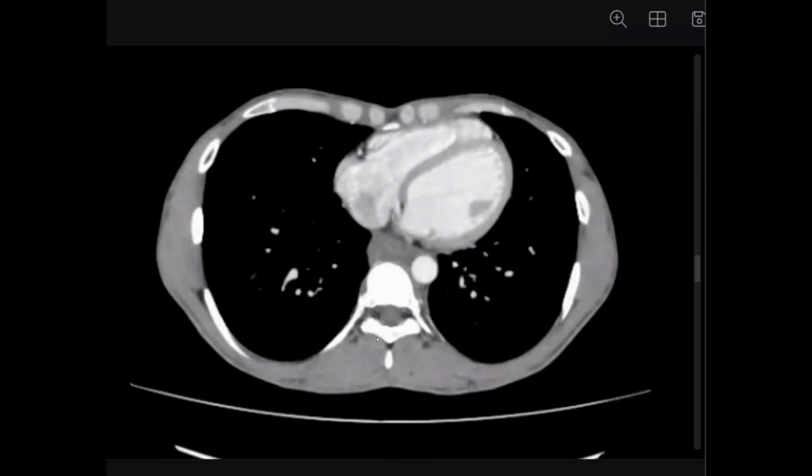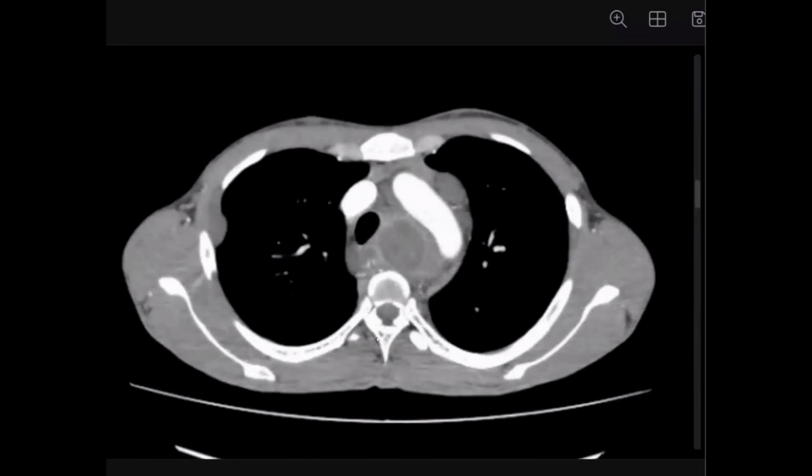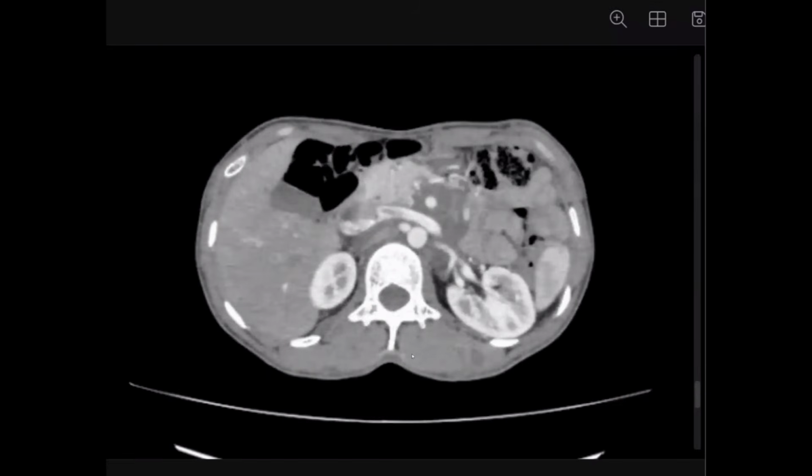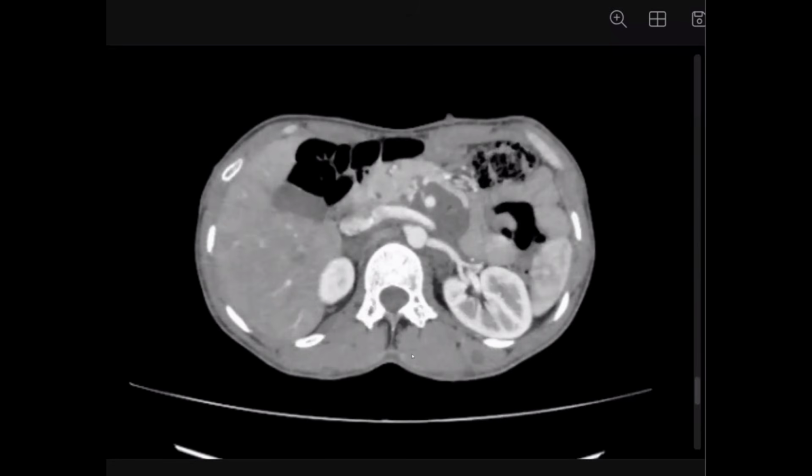Okay, what else? Retroperitoneal masses, maybe neoplastic. Nerve sheath tumors. We have retroperitoneal masses, maybe retroperitoneal sarcoma, neurogenic tumors, lymphomatous, germ cell tumors. But if I want to tell you this one is a neurogenic tumor, how can we confirm?